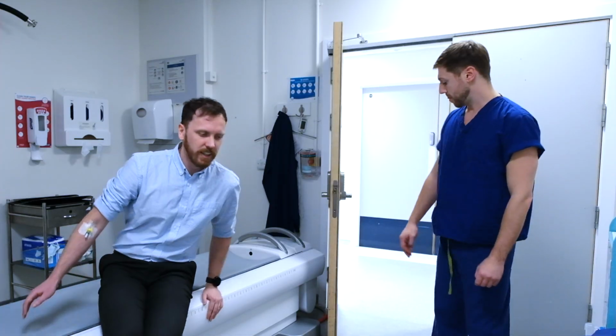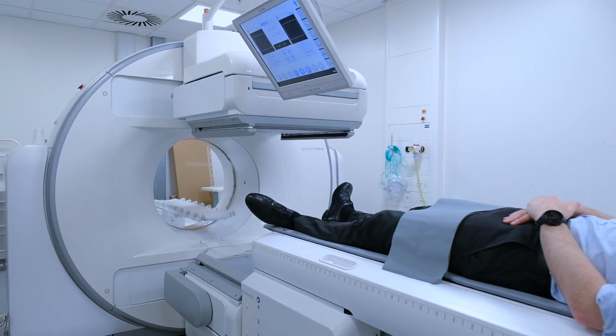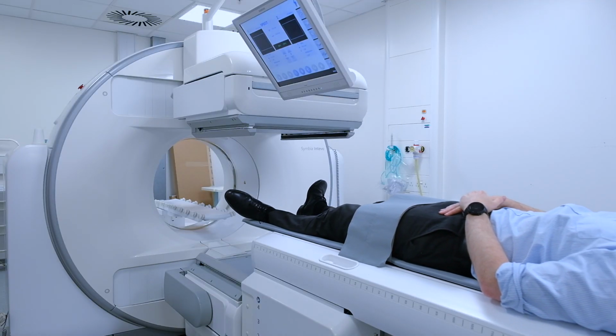We'd still bring the patient, but instead of bringing them into the clinic room, we would take them straight into the camera room. We'd explain the test to them, ask them exactly the same questions, and then we would ask them where the area of pain is greatest, if it's a generalised joint pain. So, for example, a lot of patients will have shoulder pain, knee pain, hip pain, but we'd identify which is the most painful joint. And then we would position the patient under the camera, focusing on that area.